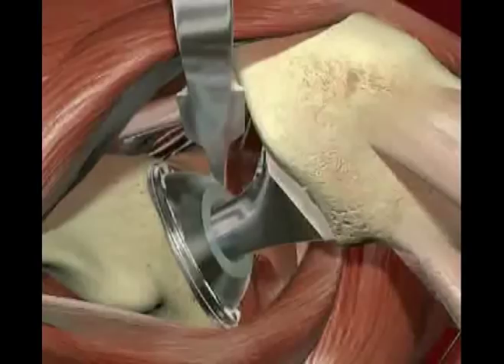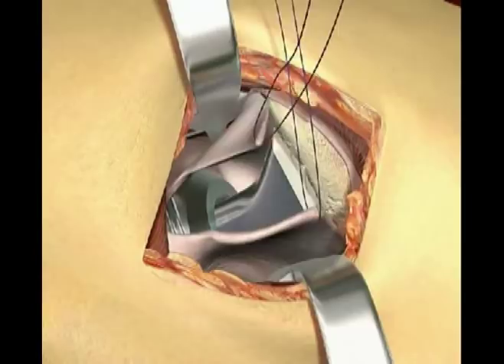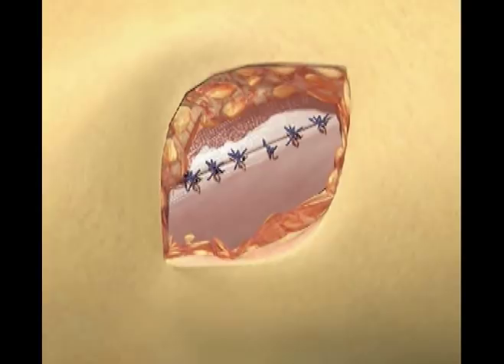The capsule is adducted using the initial holding sutures and closed with three single stitches. The fascia, tractus iliotibialis, is closed using several stitches. No muscle has been cut or divided. The visualisation of the joint is excellent and the implants have been accurately positioned and aligned to restore joint stability with a full range of motion through an incision of only 6 to 8 centimetres.